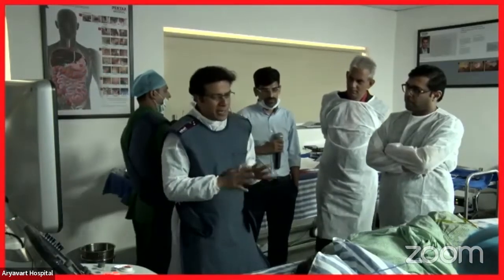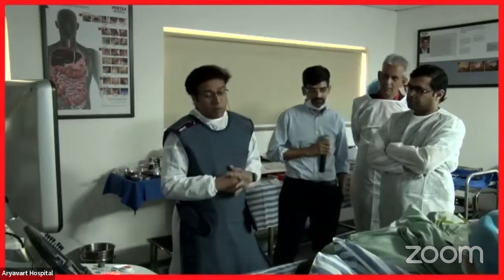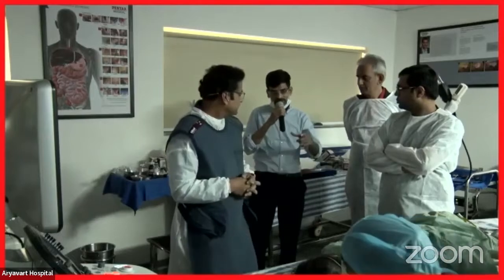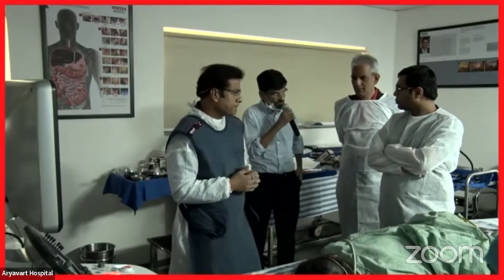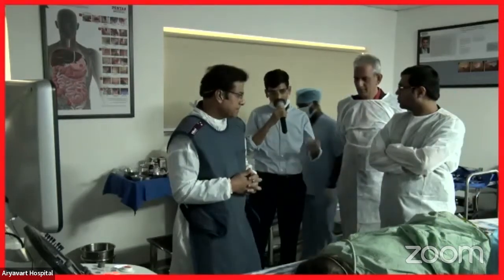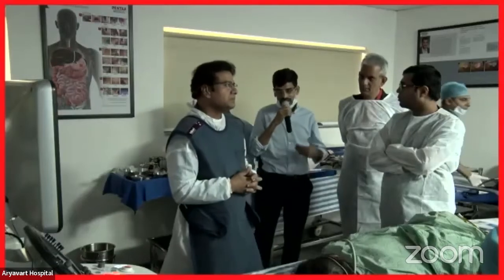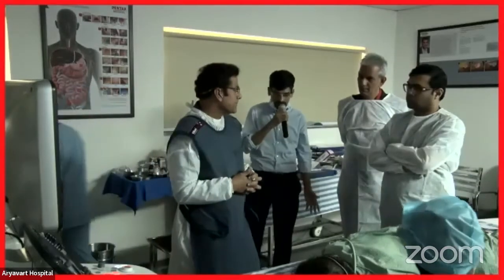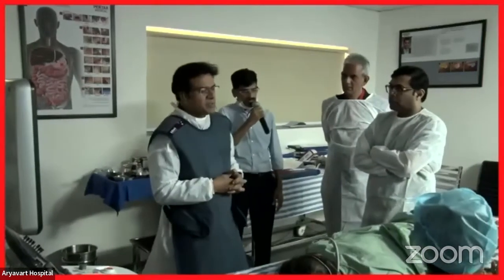We have done a good number of cases now, and fortunately we have not encountered a major complication. We've actually improvised and created an indigenous double balloon. A couple of centers in Hyderabad have used it. Like you said, it is really important that we enter the jejunum and it's adequately distended and not running away from you. We've only done one patient so far with the double balloon, but it does help with the distension.